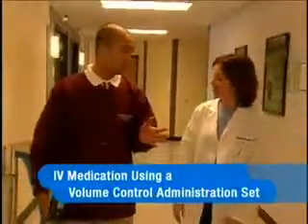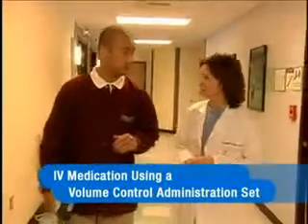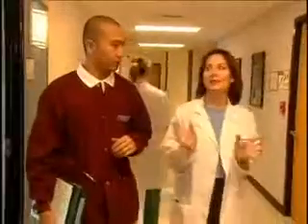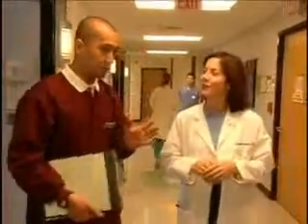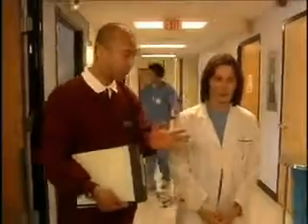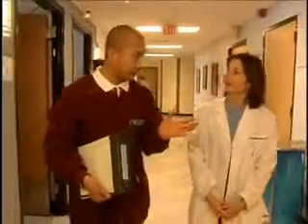Are you ready for my next patient? You bet. I know you have an intravenous medication to administer. It will be given using a volume control administration set. What is that exactly? Well, that's when the medication is diluted in a small amount of solution in a volume control set and administered through the patient's IV line, right?